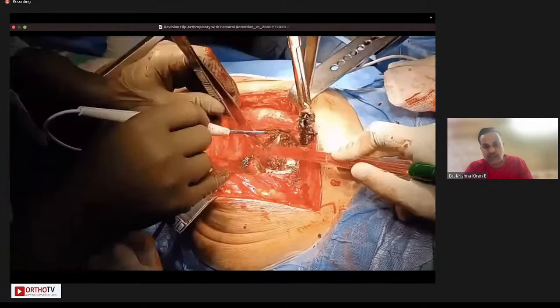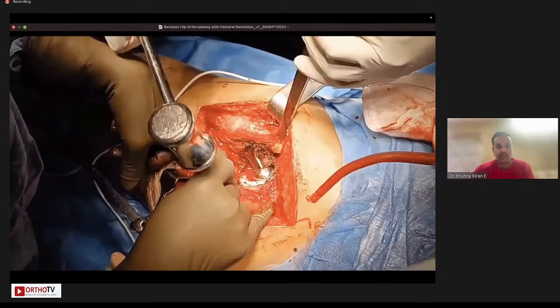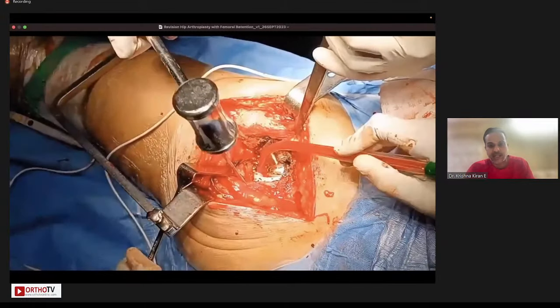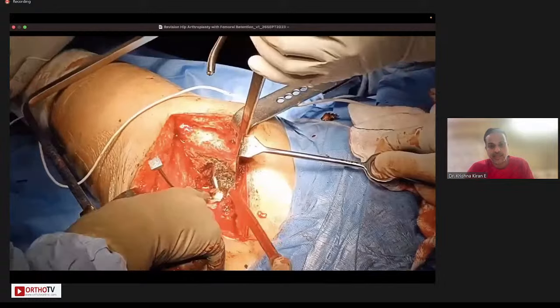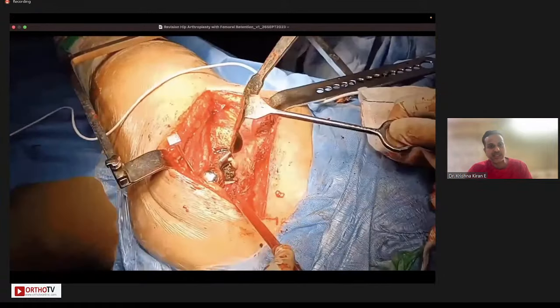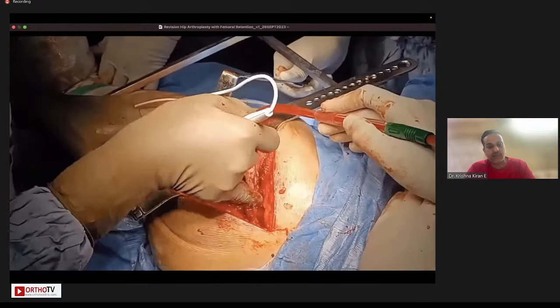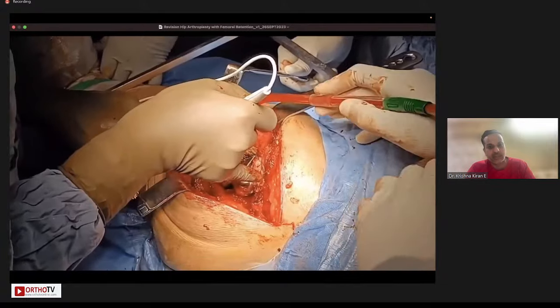And we must not dislocate the femoral head because it gives us the confines of the acetabulum, for the posterior and anterior dissections. And once that is completed, that is when you dislocate the femoral head. Now you assess the extent of internal rotation of the femur. And if you are not able to get the femur beyond 90 degrees, we do subsequent releases.